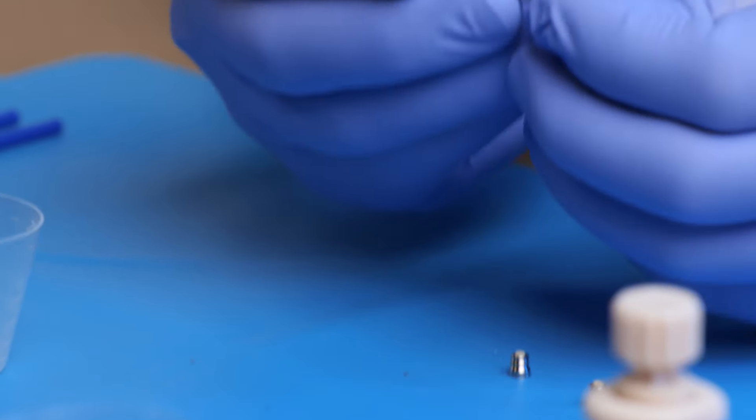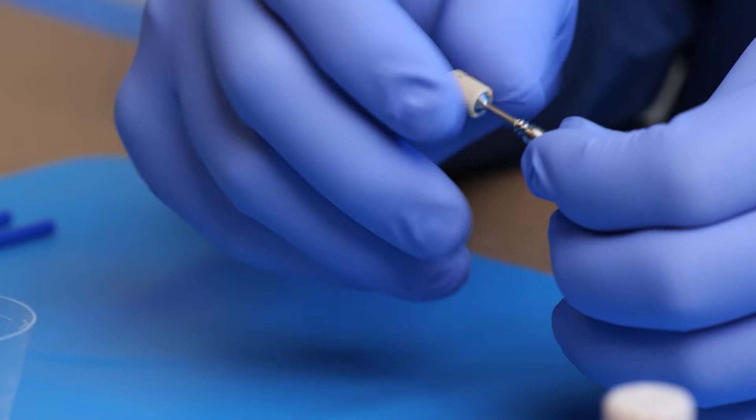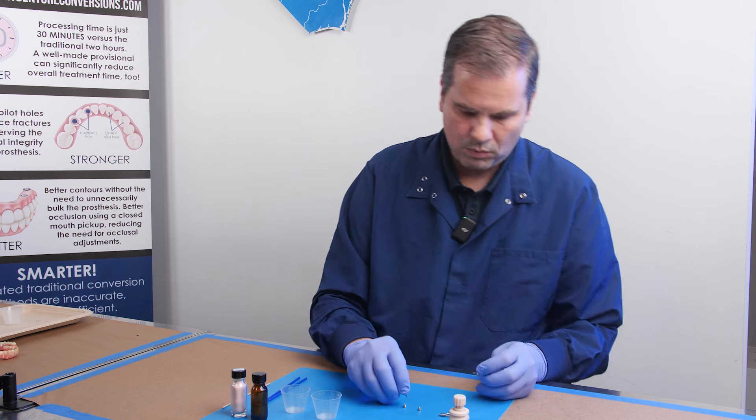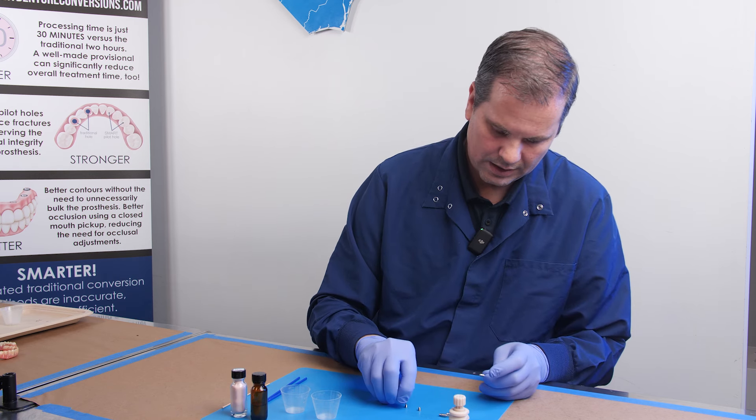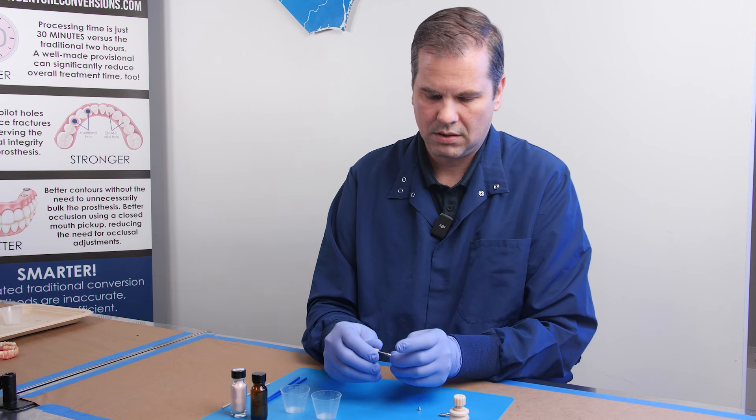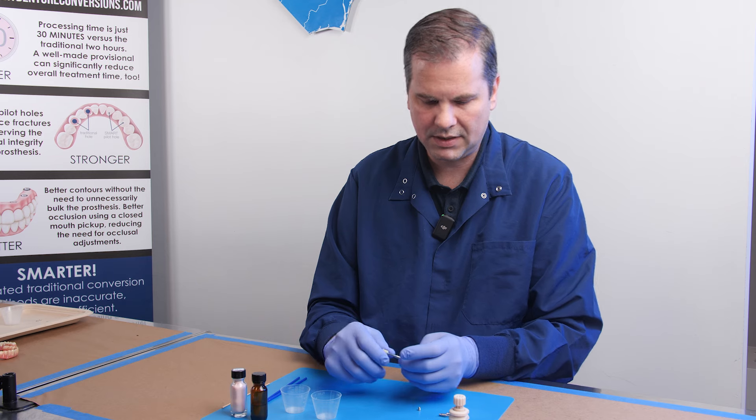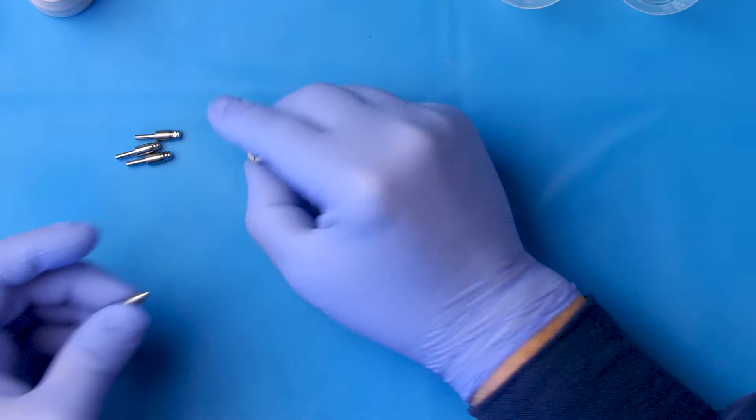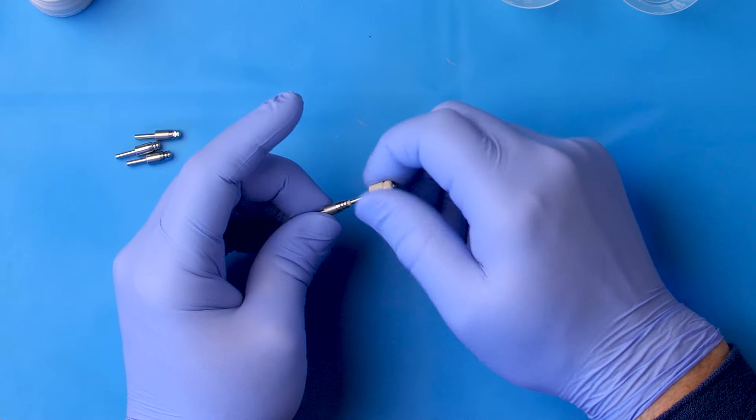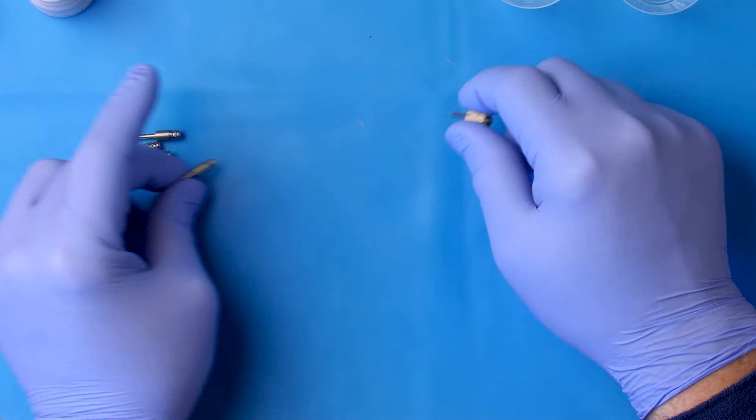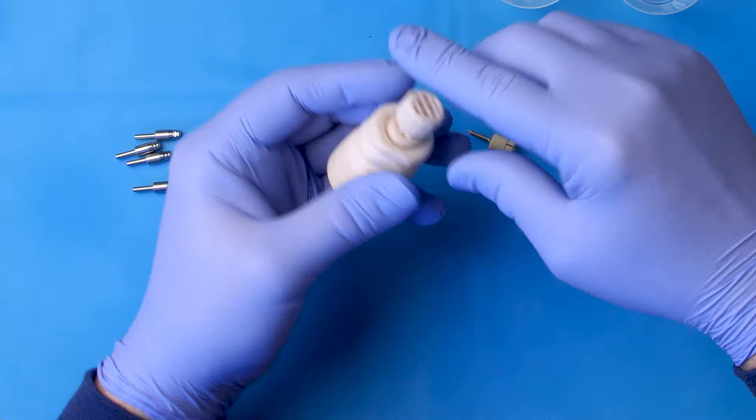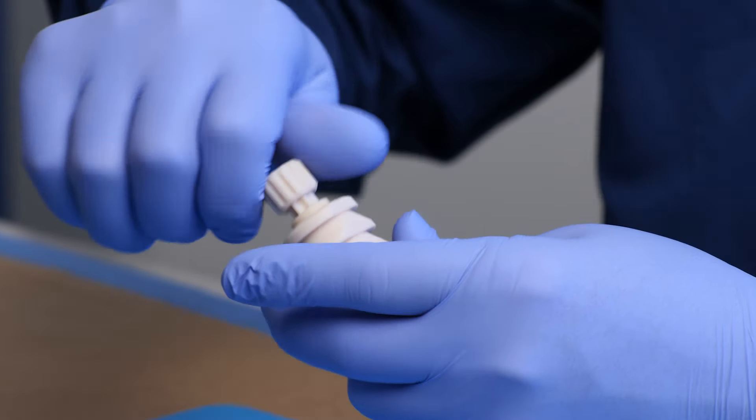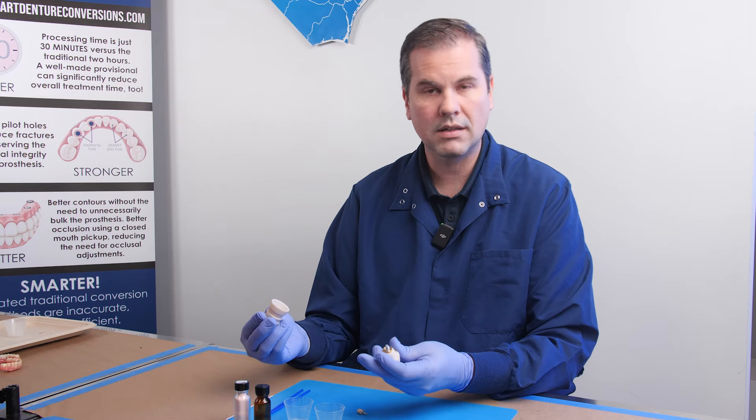Now, this torque driver is designed so that you can't over-tighten the separable fastener. It is calibrated to 0.7 inch-ounces, which is very low torque. If you use a normal driver, you run the risk of driving it, driving it, and then all of a sudden it pops off. And you're like, oh no, I just broke my screw.